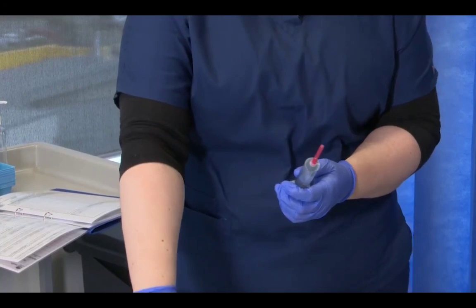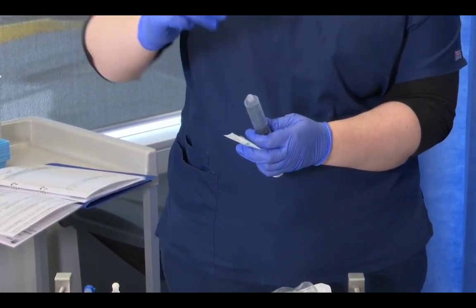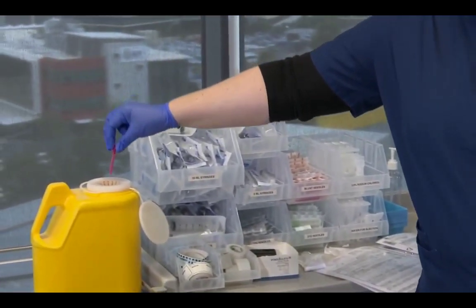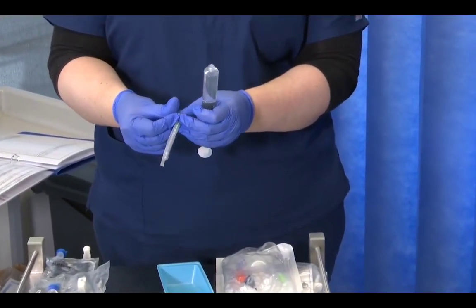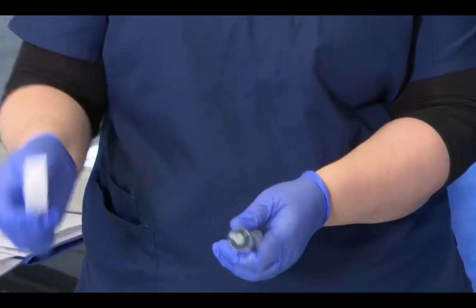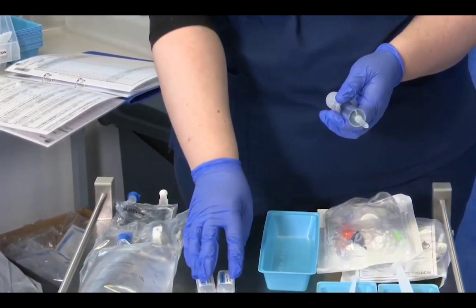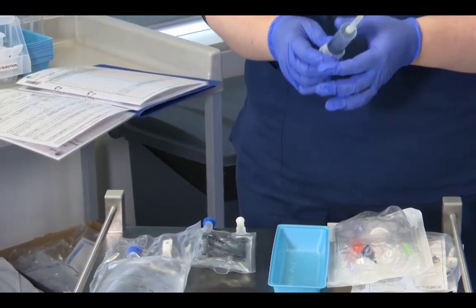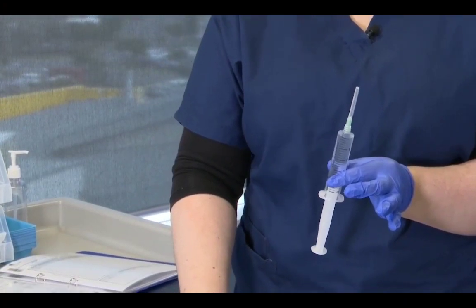Now I'm going to attach my green needle. So the red needle comes off, and again it's a sharps. It goes straight into the sharps bin, and our green needle goes on. Again, I'm going to need my tray in a moment to recap. Now that I've got this green needle on, I'm ready to inject into the bag.